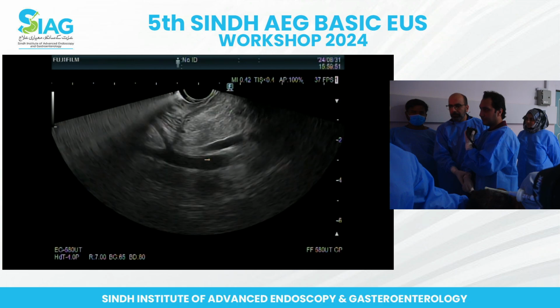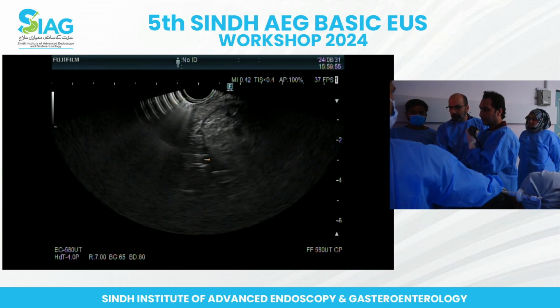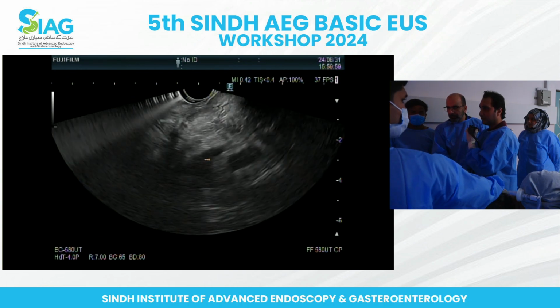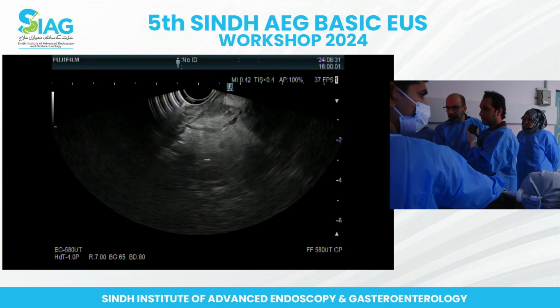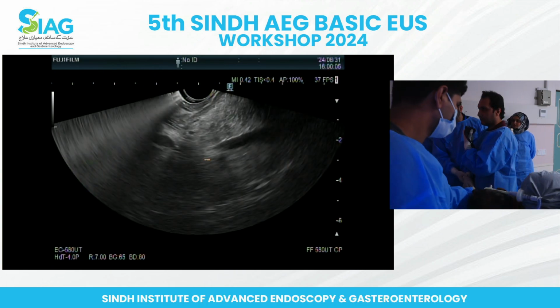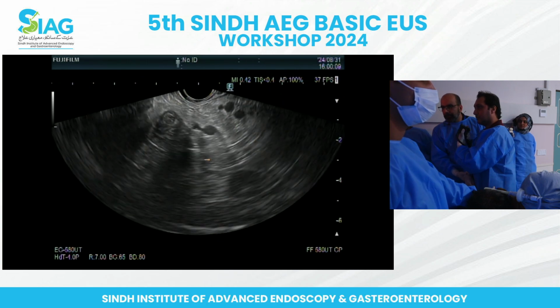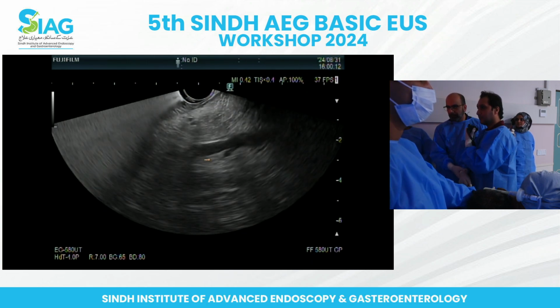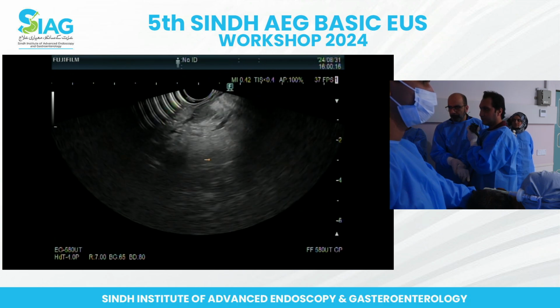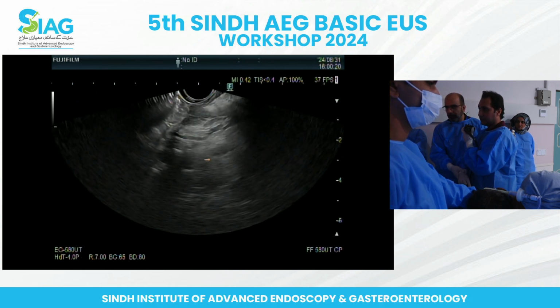Yeah. Okay, good. So where was that area of abnormality? So keep, because we saw this big mass lesion. Maybe it was a lymph node. So keep, now maybe it's in the uncinate, so keep going clockwise here. Keep going, nothing. Okay, pull back. Maybe they were the lymph nodes that we saw.